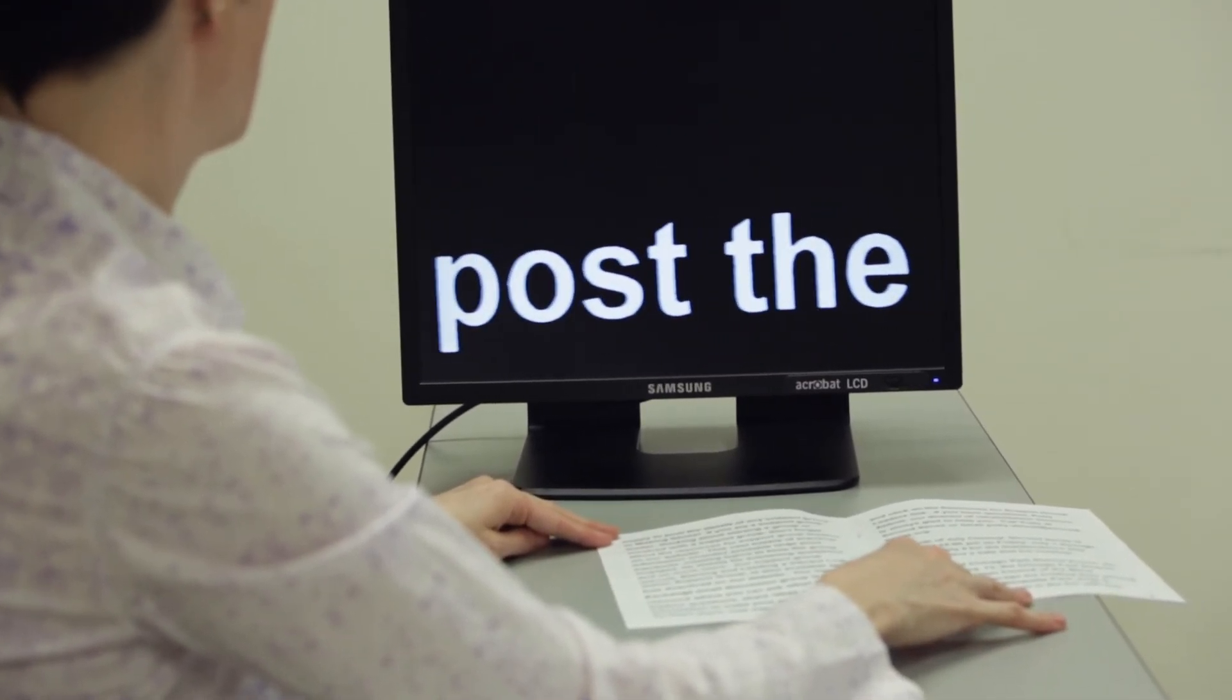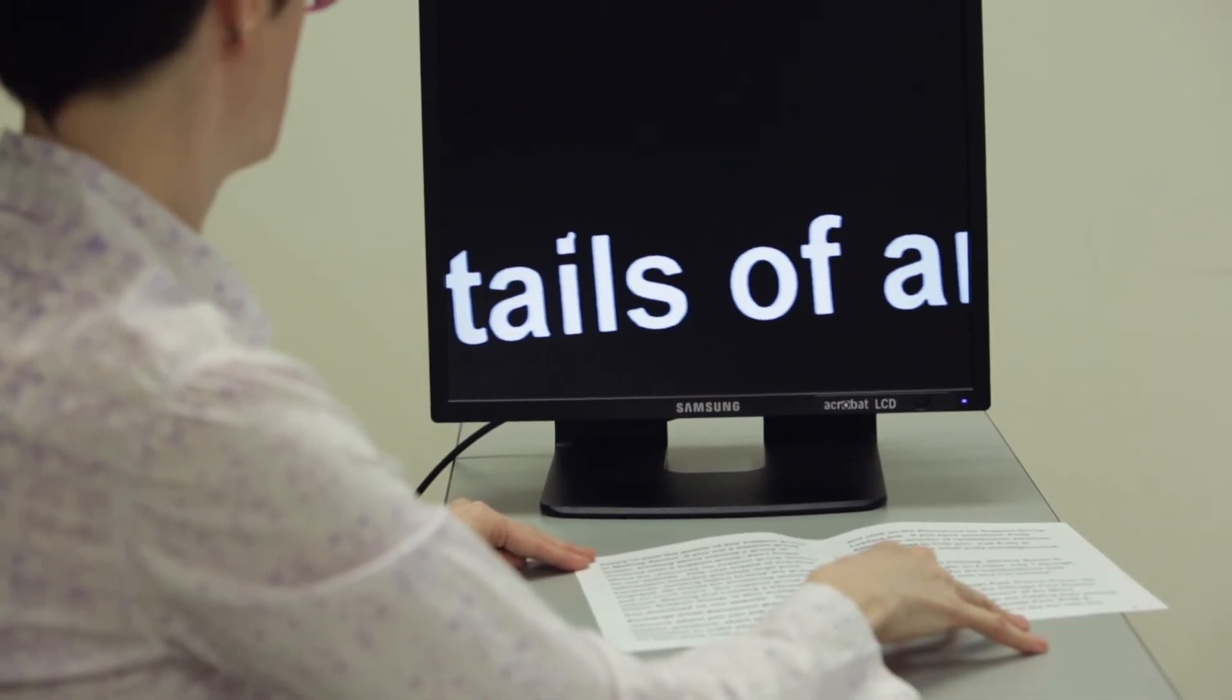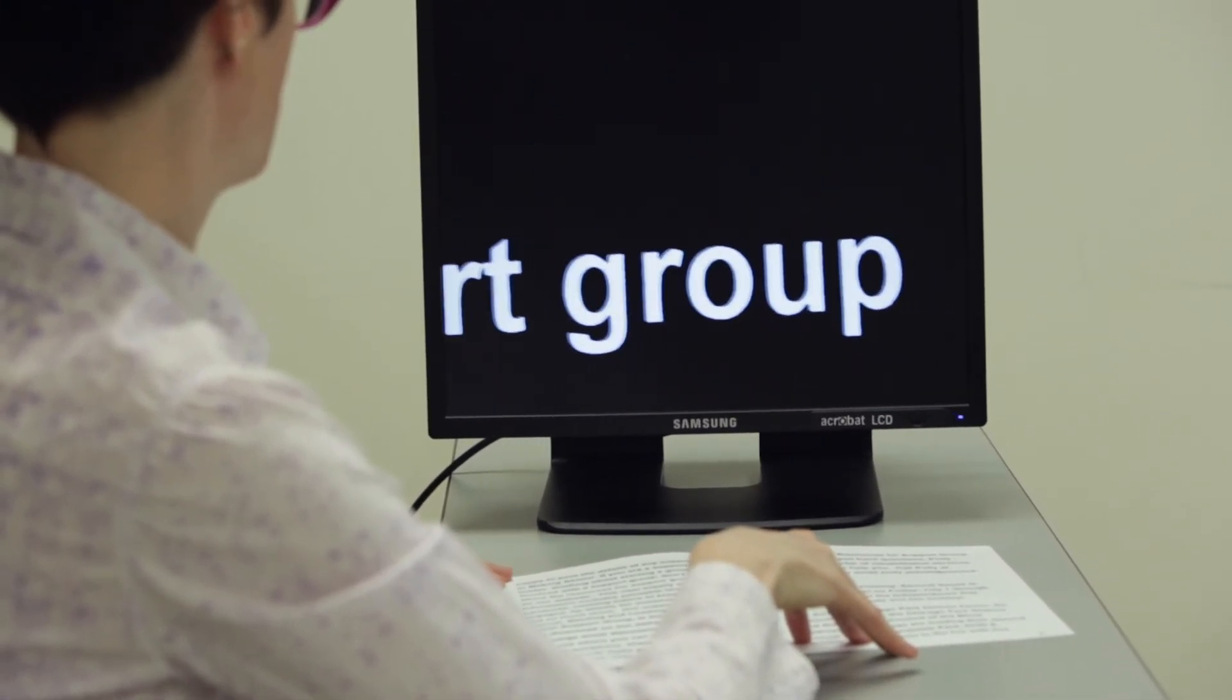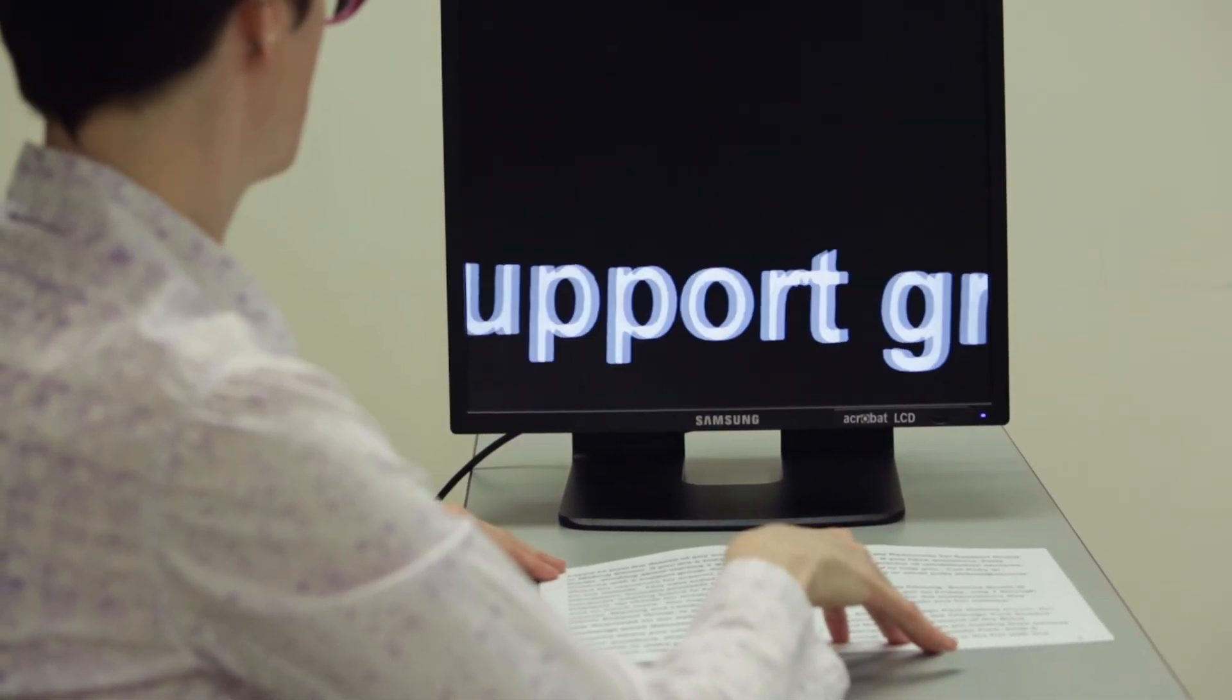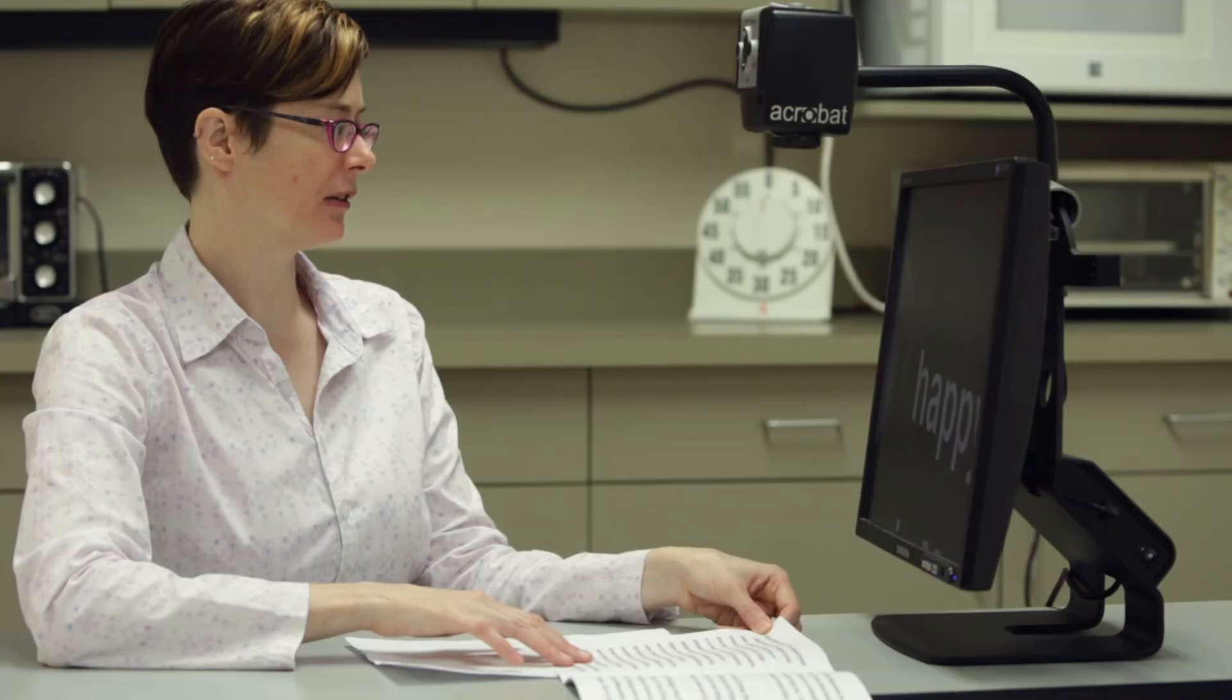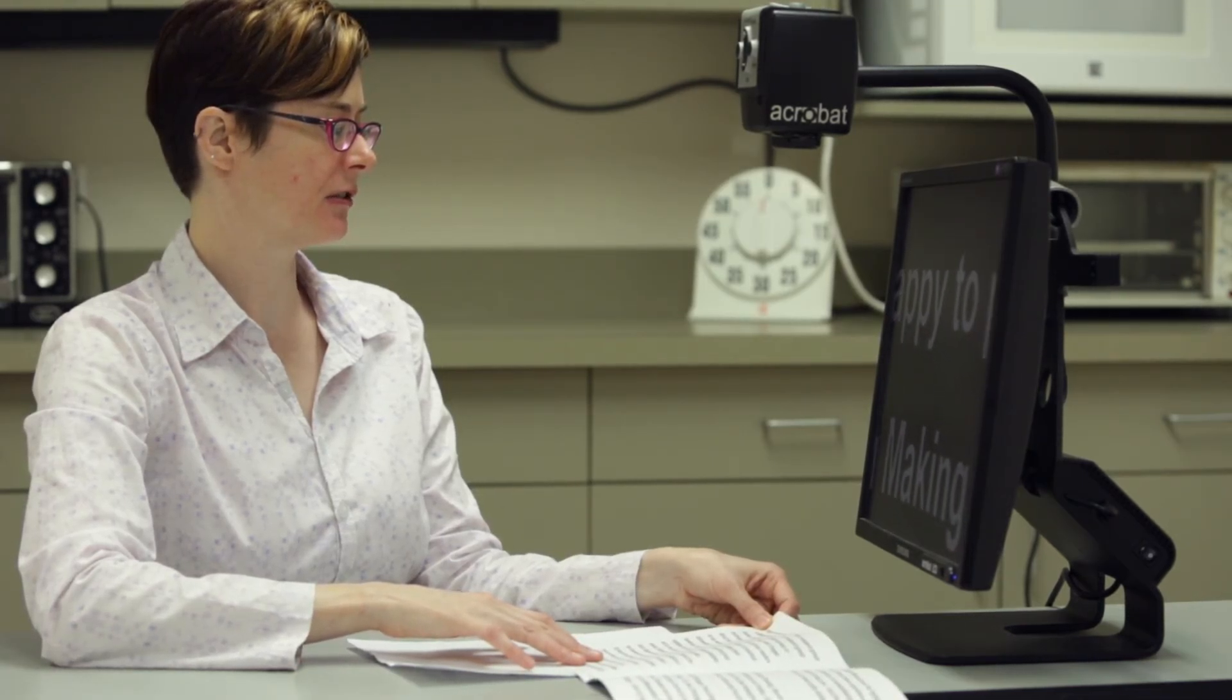And with video magnification, you can use the bottom of the screen to help you track along the line. Again, the technique is the same. When you get to the end of the line, track back over what you just read. There's my thumb, and then carefully make your way down to the next line.